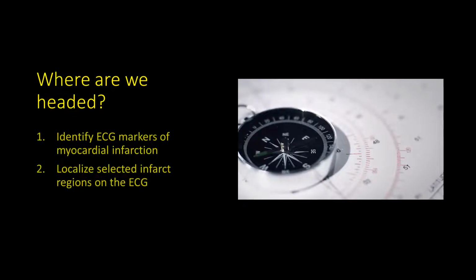So let's begin. The objectives for this webinar are the following. At the end of this presentation, I hope that you will be able to identify ECG markers of myocardial infarction, and secondly, that you will be able to localize selected infarct regions given a 12-lead electrocardiogram.